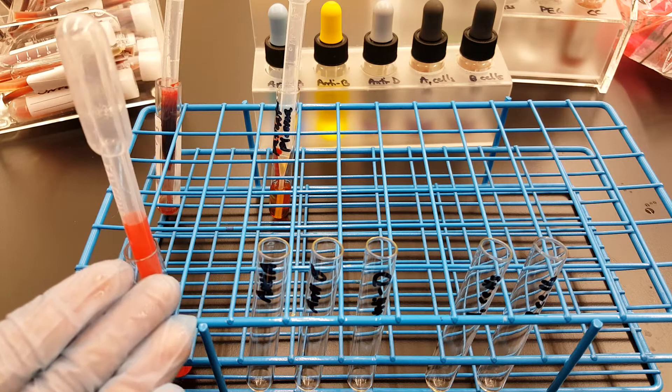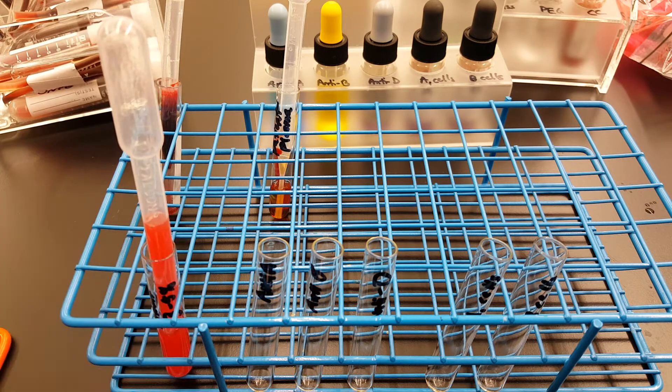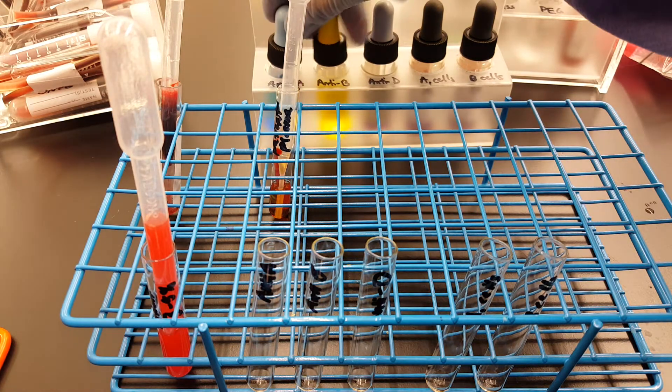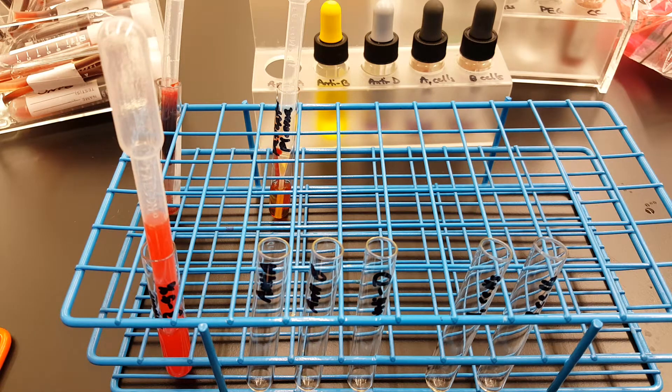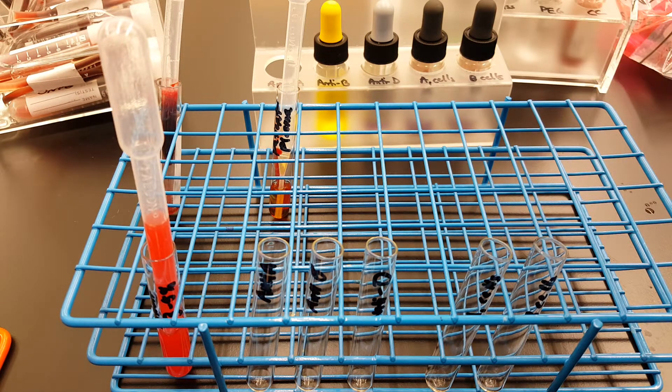So I have my cell suspension made over here on the left, and what I'm going to do now is add the reagents first so that you know that they're there, and then continue by adding the patient sample.